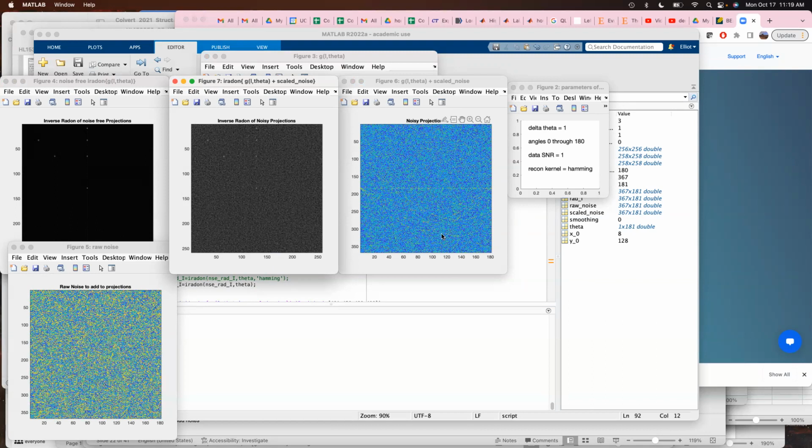However, there's a correlation that exists in that data along those sinusoids, and that shows up as this dot, which is pretty impressive. It's hard when you're trying to manipulate CT raw data in the projection space, because a lot of the things you're trying to manipulate are very difficult to observe there.